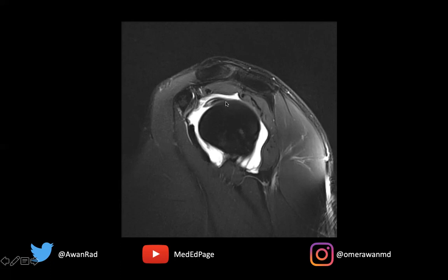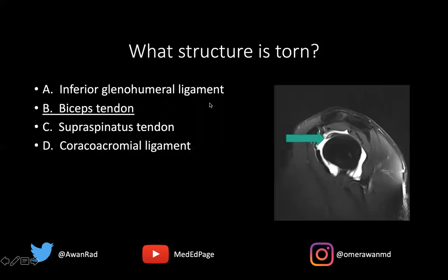Along the supraglenoid tubercle of the glenoid process of the scapula. So this is a biceps tendon tear, because we have increased signal within the substance of the biceps tendon here.